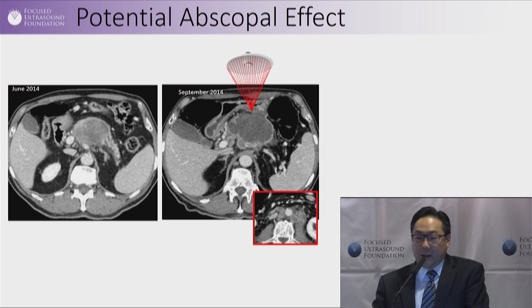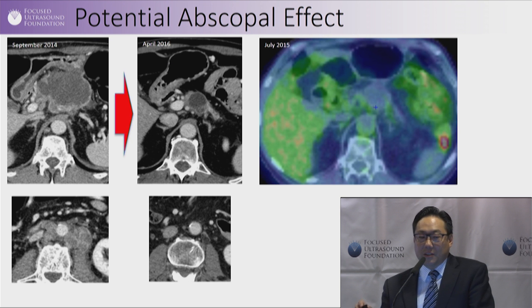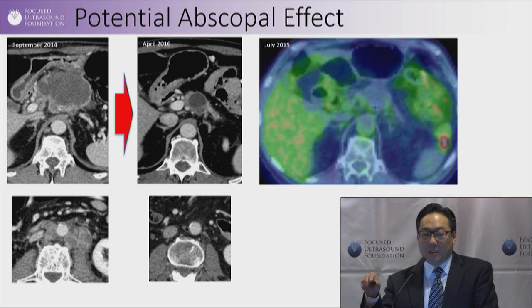In the box below, there is an image of lymph nodes that are adjacent to the aorta. So these are metastatic sites of cancer that are enlarged. What this is going to demonstrate is something called an abscopal effect, where we treat the tumor. These lymph nodes were not treated, but in the process of treating this, somehow the immune system got upregulated. And again, the image on the left is the immediate post-treatment. You see the enlarged nodes. And then following that, you'll see the first images from September 2014, and then in April of 2016, you see that same area just to the right, there's no evidence of any lymph nodes.